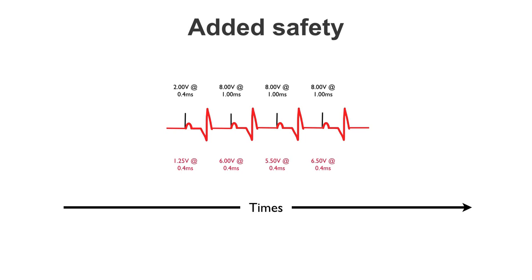And what pacemakers usually do is just ramp up their output pulse to the max. In most pacemakers, this will be around 8 volts at 1 millisecond. And you can see that the pacemaker has recognized the problem, adapted, and we're still managing to cause the atrial tissue to depolarize. In actual fact, the pacemaker is still performing. Now, this will be picked up at their next follow-up or in pacemaker clinic, and we can do something about it. The important fact is that this person will still have a healthy heart rate.